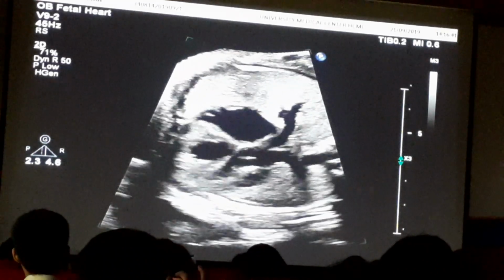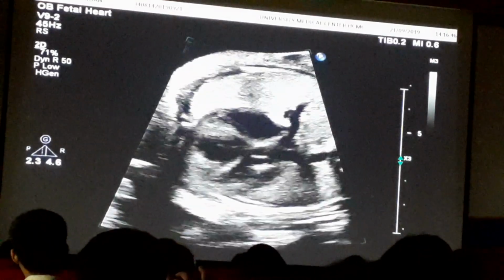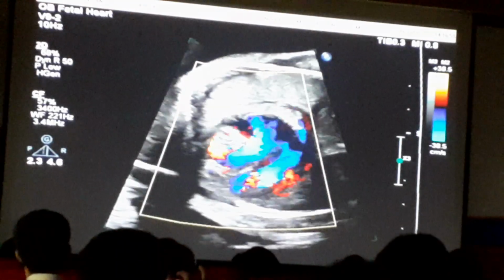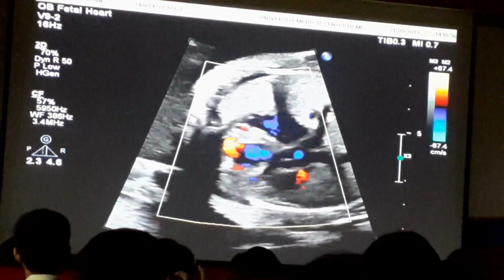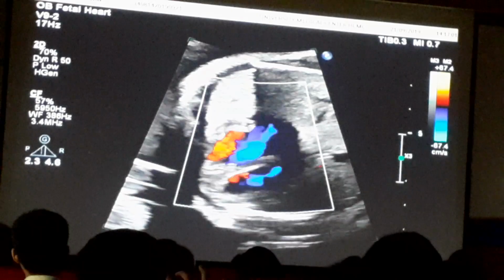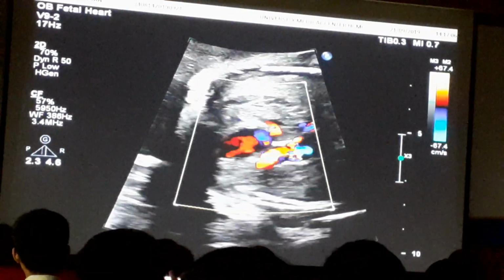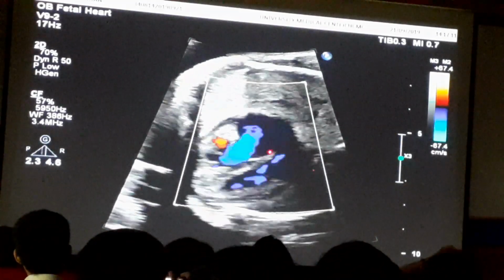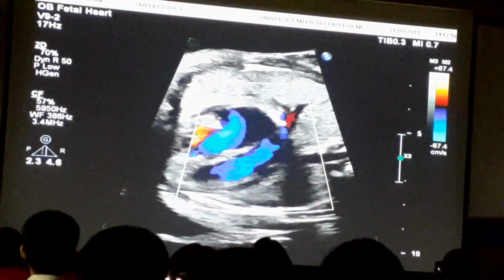Okay, so other things to note, there's the PA bifurcation. Động mạch phổi thân chung, quite easy to see. Động mạch phổi phải. We want to look for any additional lesions. Chúng ta khảo sát thêm một số tổn thương khác, ví dụ có thông liên thất hay không. Ventricular septal defects, semilunar valve stenosis. Hẹp van bán nguyệt, hẹp van động mạch phổi, hẹp van động mạch chủ hay không. I don't see any of that. Không có bất thường đó.